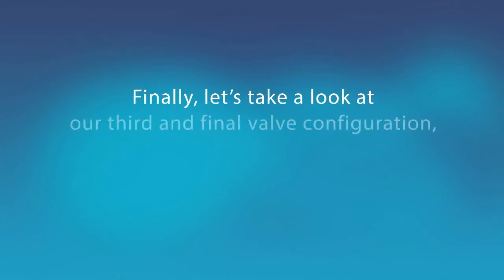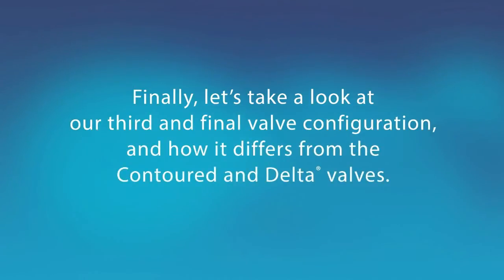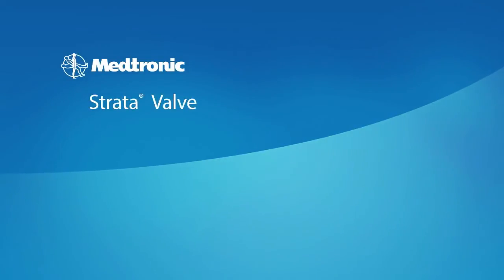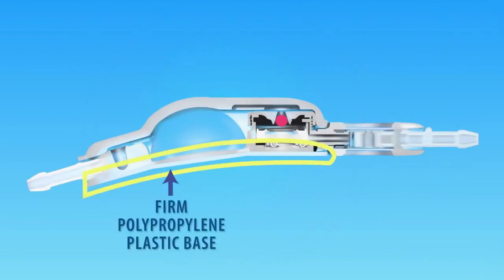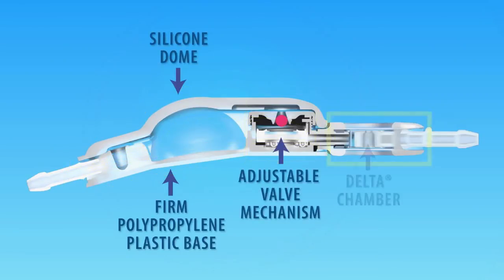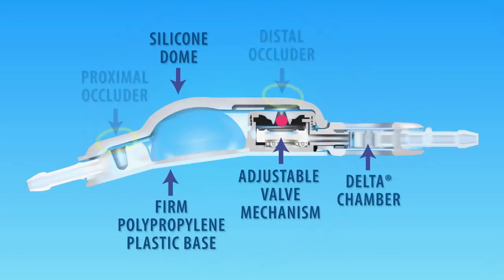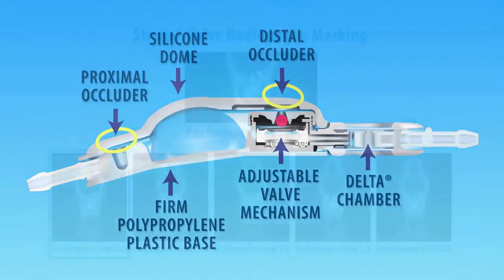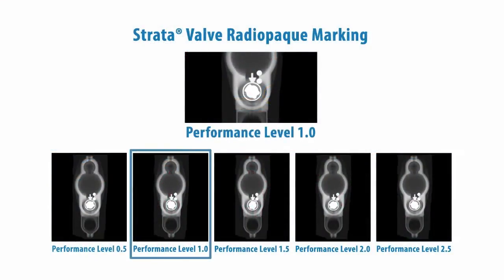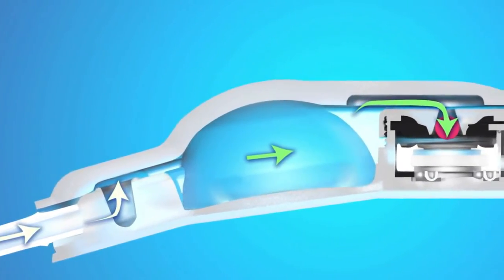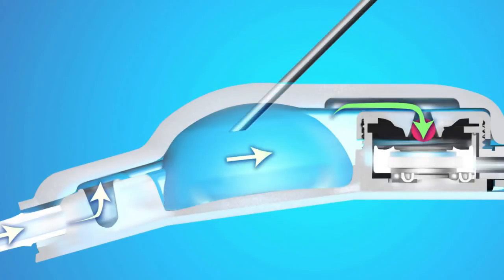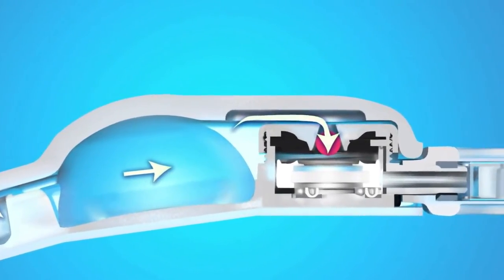Finally, let's take a look at our third and final valve configuration and how it differs from the contoured and Delta valves. The Medtronic StratoValve consists of a firm plastic base, a silicone dome, an adjustable valve mechanism, and a Delta Chamber for siphon control. The StratoValve also has proximal and distal occluders for selective flushing. Additionally, the StratoValve has radiopaque markings to indicate flow direction and orientation of the valve in the X-ray image. As CSF flows through the StratoValve, it enters the inlet connector, flows by the proximal occluder, and into the central reservoir. For sampling CSF, the reservoir dome can be accessed using a 25-gauge or smaller non-coring needle. From the reservoir, the CSF flows into the cone opening of the adjustable valve mechanism.